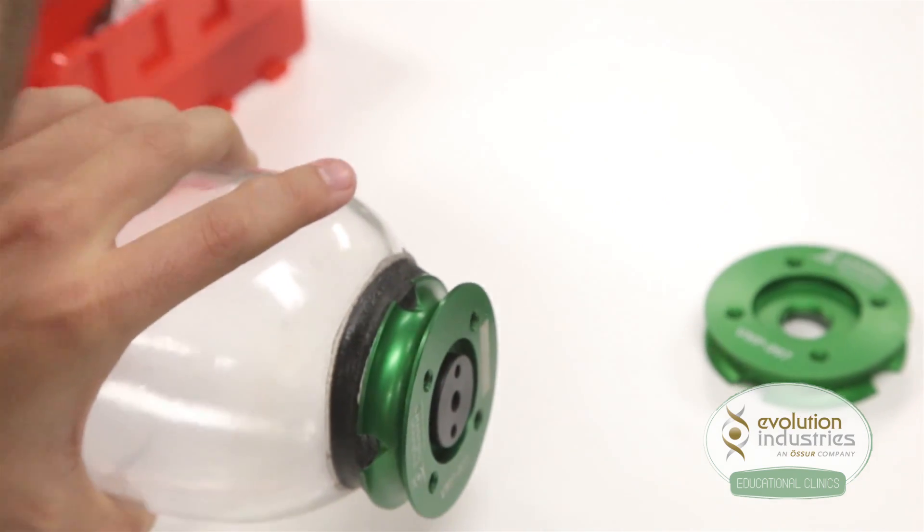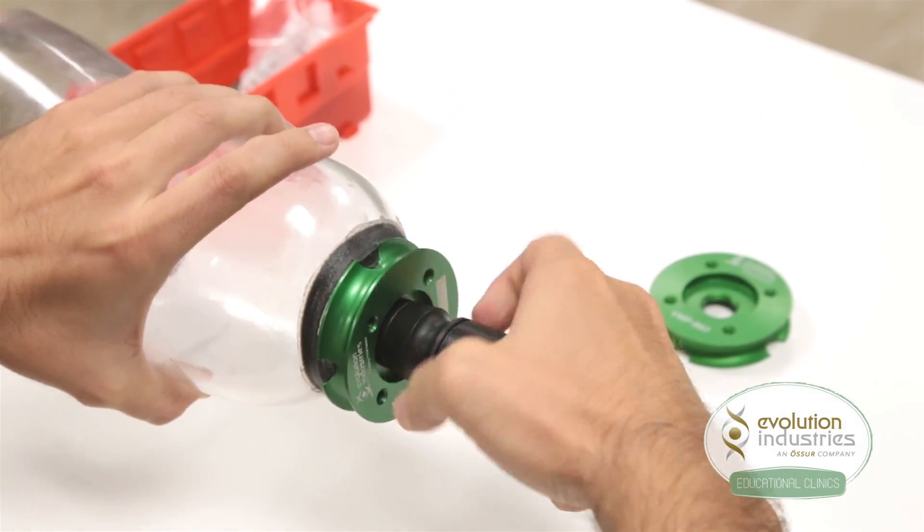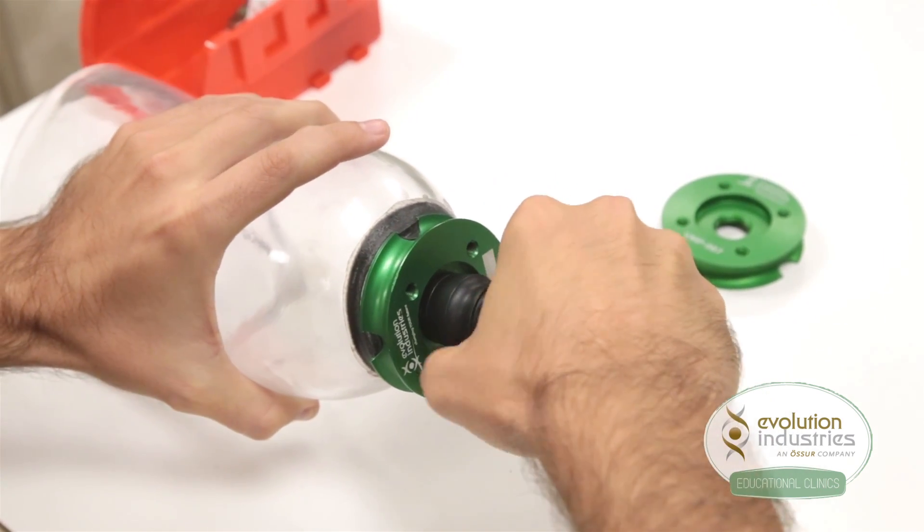Twist the housing clockwise to secure it into the mounting plate. Using your wrench tool, part number WT-001, tighten the housing and ensure a good seal on the distal end of the socket. Just be careful not to over-tighten.